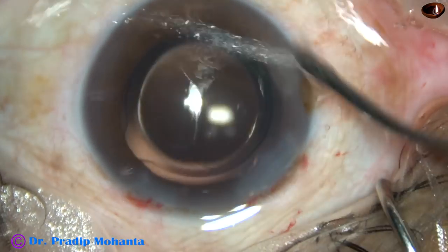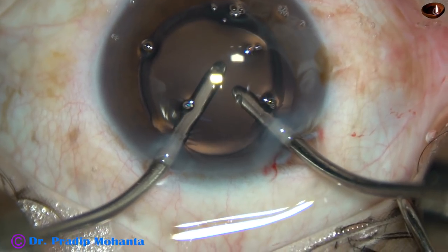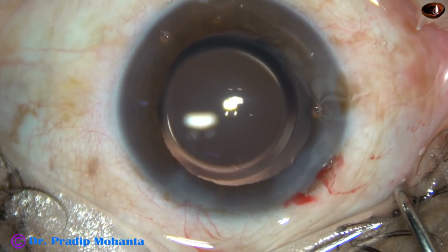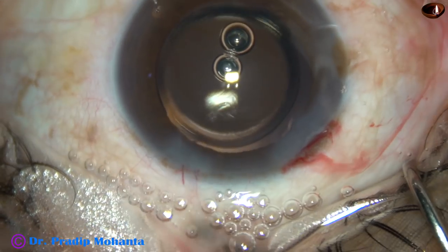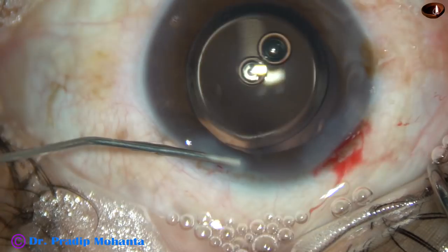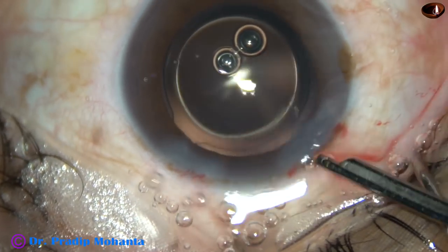Since there is only one side port, I'm using the main wound. The key is you lift the anterior leaf of the main wound a little bit — leakage is very minimal — and you can keep the AC formed in that way. And now this is a bit of MOXIFLOXACIN, and then the only one side port that was made is hydrated. The stroma on either side of this stab wound is hydrated and the wound closes.